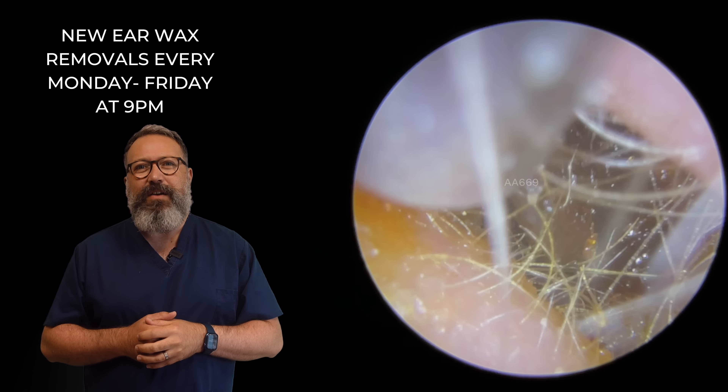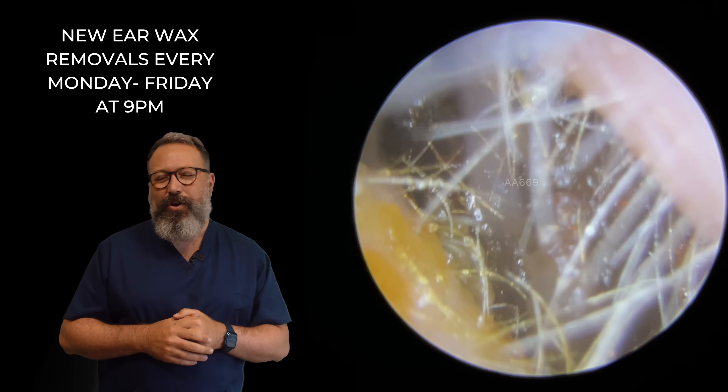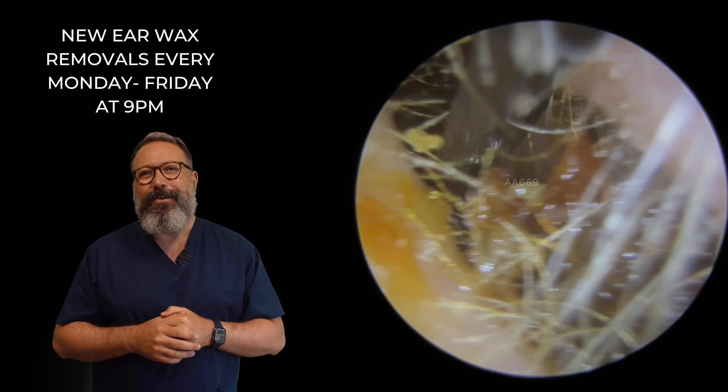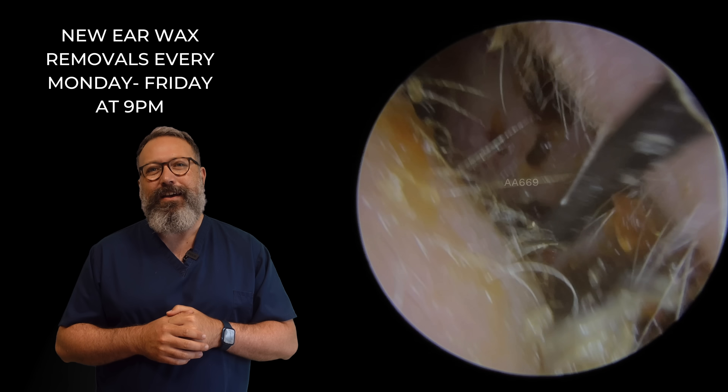Let's see if we can get this out. No, it just doesn't want to come out — it's a little bit too wide. So we're just going to sneak over the top here with the Jobson horn. There we go. And roll this down the canal. There we are — out that comes.